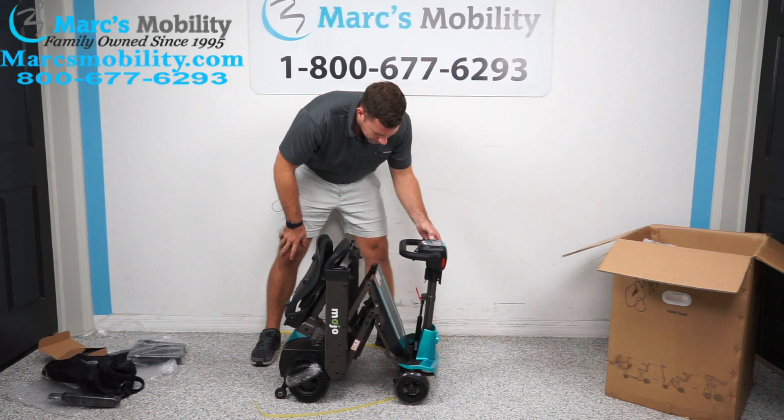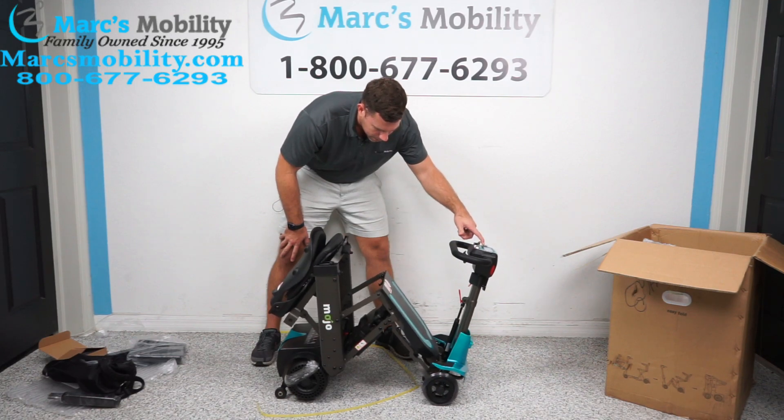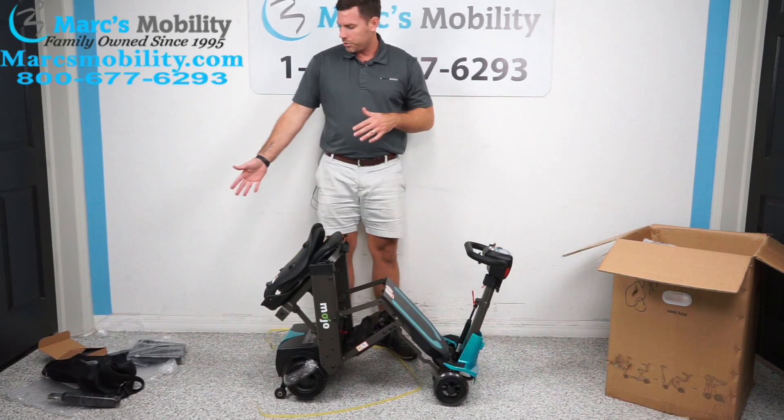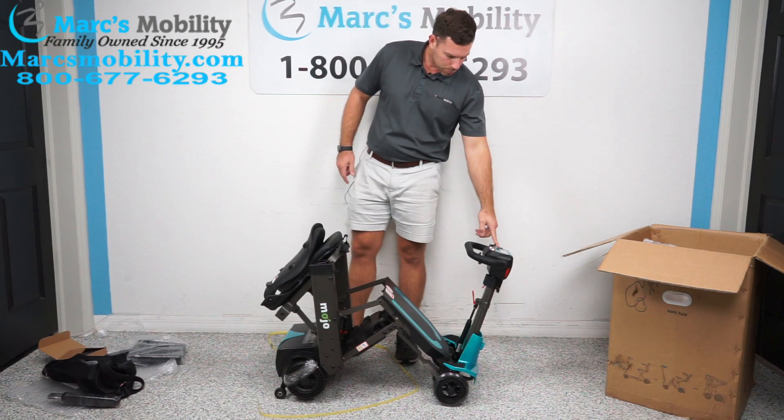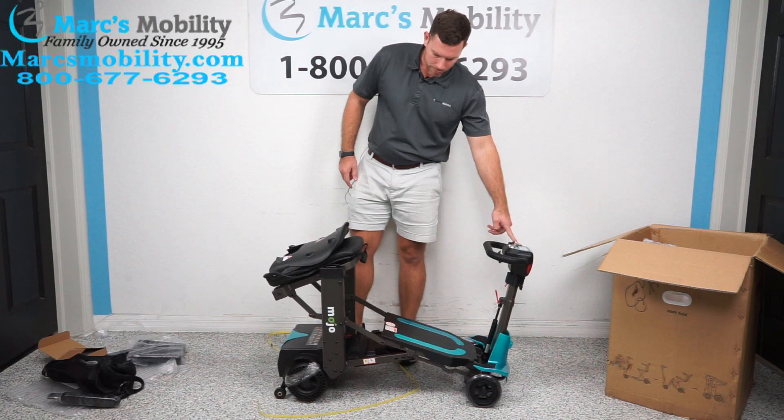This button actually works differently from other units — this one stops when you let go of the button. A lot of other units, you press it and it unfolds automatically. This one looks like you would hold down the open button until it's in the fully open position.